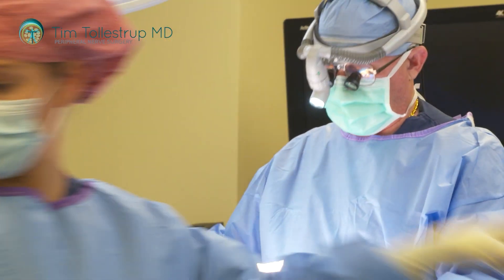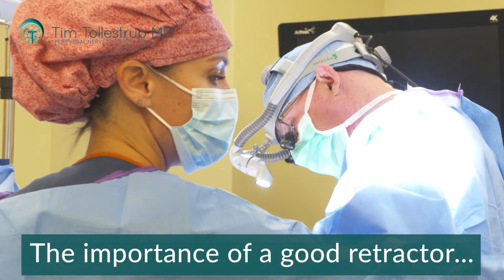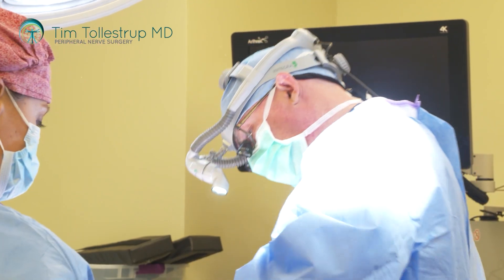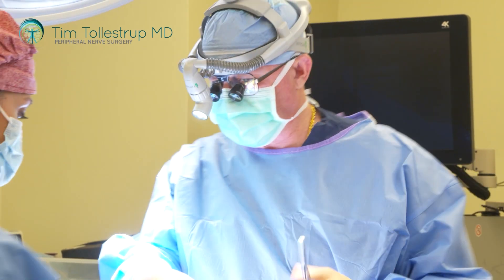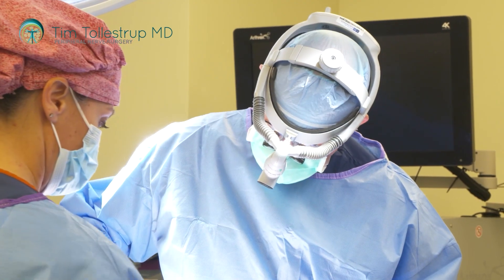Using the retractor is a critical part of the operation — it's hard to do this operation without good retraction to keep everything steady. But at the same time, you have to be very careful about how you use it and the pressure that the blades are exerting, because there are all these important structures and other important nerves running underneath this tissue.